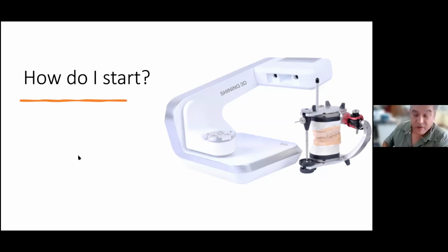So how can we start? Like I said, you need a scanner, definitely. You need a CAD software, and you need PC hardware. You cannot just pull any laptop from the market and say, let's go. It will not work.